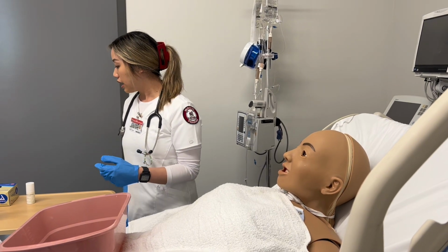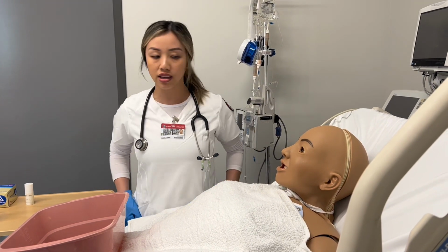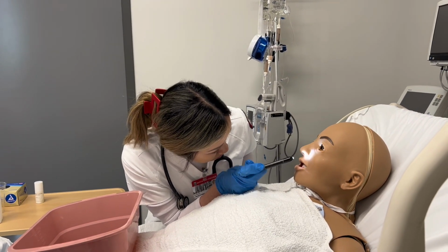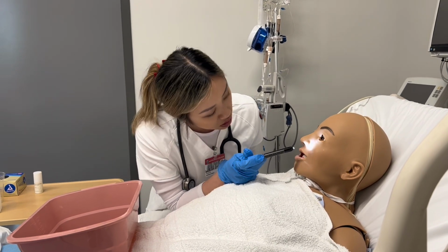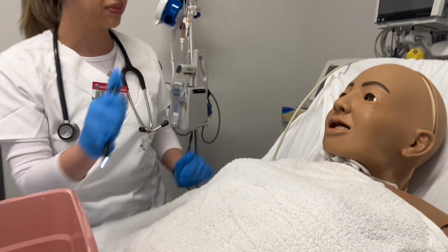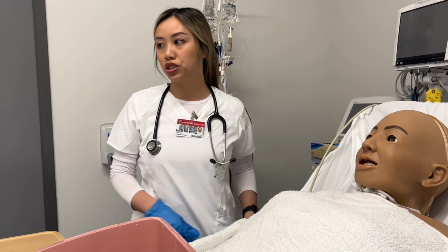And then at this time, I'll assess his nares too, just to see the patency of it. Okay, so I'm looking into his nares. I see that the left one is a little bit deviated. So I'll pick the right nare here. Okay, so then at this time, I'll measure my tube.